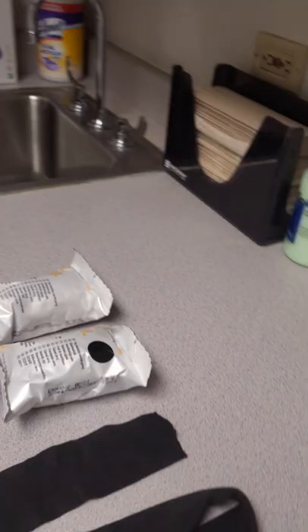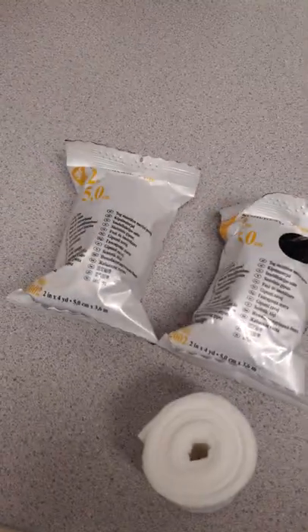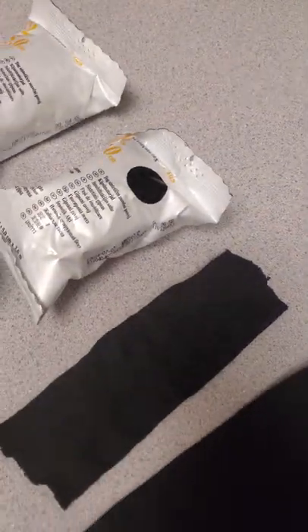Hi everybody, welcome back. We're going to do a quick video on how to properly apply a fiberglass thumb spica cast using materials. We are going to be using stockinette, fiberglass, and cotton padding. We're going to jump right into it.